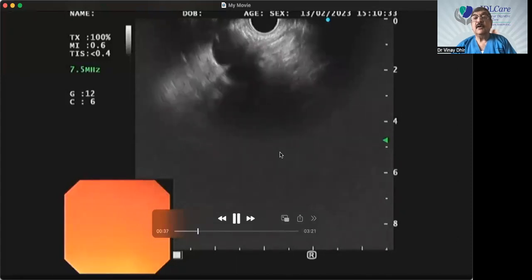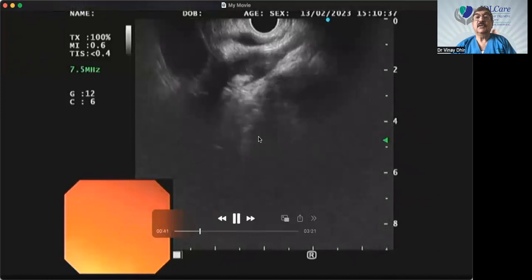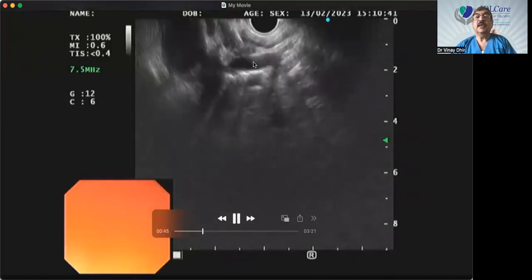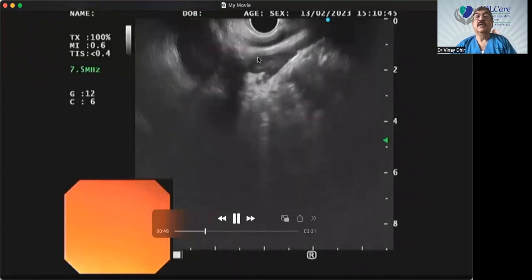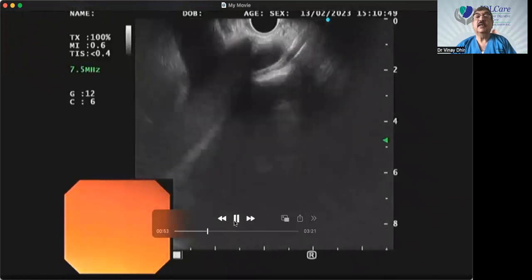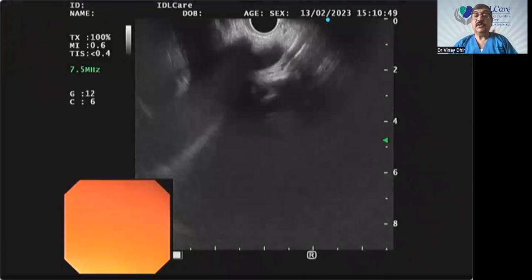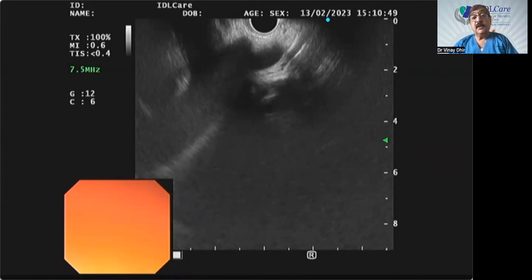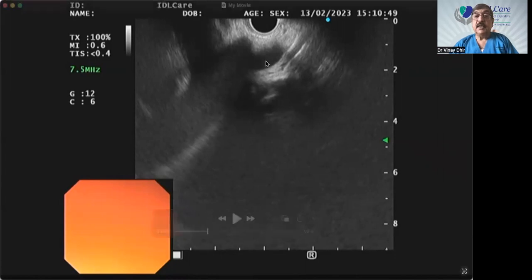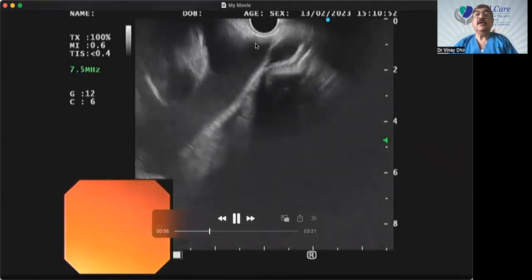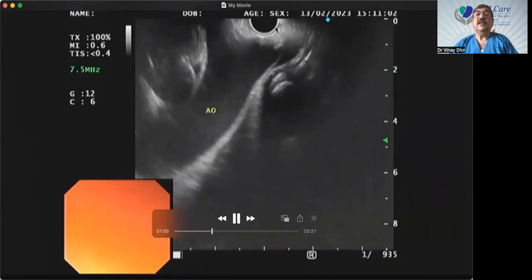Going a little clockwise then anticlockwise, but the general direction is clockwise. You see there is a big vessel now — this is the common carotid, and there is another vessel coming here: the internal jugular and subclavian joining to form the left brachiocephalic vein. We have pushed down maybe a centimeter and we are seeing the common carotid artery, the internal jugular vein, and the brachiocephalic vein. To see lymph nodes in station 1 — just below the thyroid — and station 2, this is the area. You have to first see the common carotid arising from the aorta and the brachiocephalic vein.